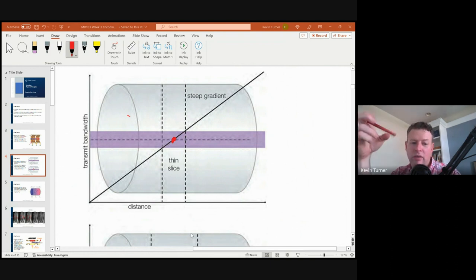It's like a big to-do when you do a pacemaker in MRI. You have to have a representative from the pacemaker company there to turn it on and off. You have to have a nurse monitoring it. You have to have a cardiologist usually sign off on it. Whether they have to be present or not, once again, I think there's people from lots of different states here, and that becomes a state-by-state thing. I know that's not a requirement everywhere I know, though, is that you've got to have a nurse monitoring vitals, and you have to have somebody there who can turn off the pacemaker itself and then turn it back on and also test to make sure it's still working once it's turned back on.